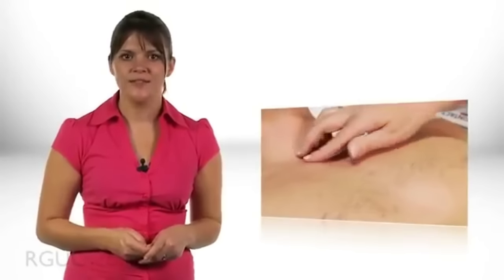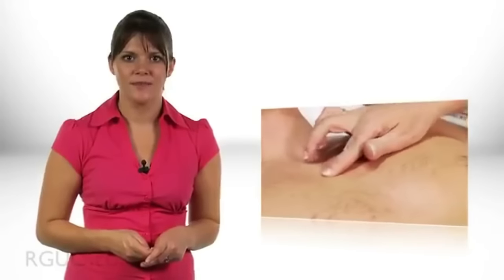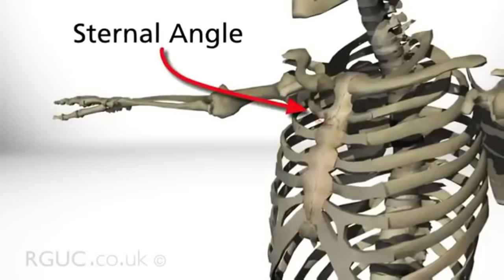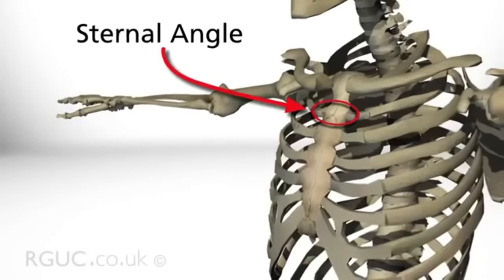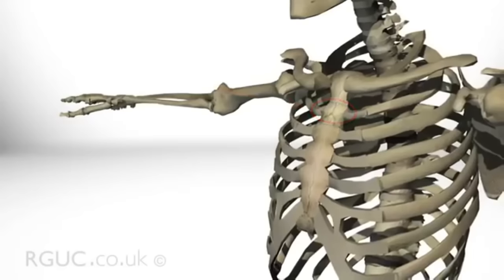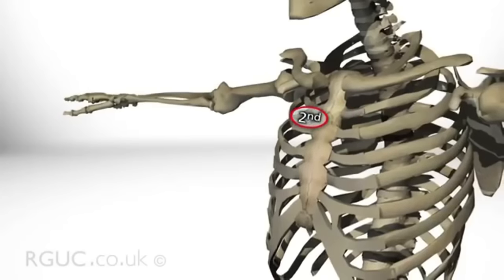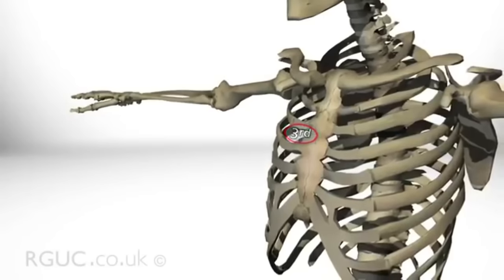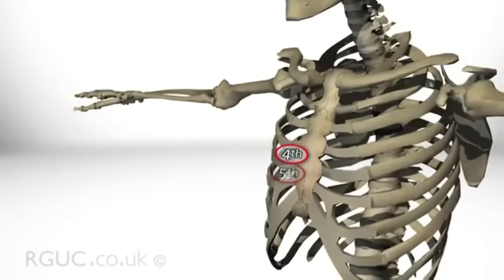Now move on to attach the electrodes for the chest leads. There are six chest leads. To locate the positions for these, use the sternal angle as a reference point to count down the intercostal spaces. The second intercostal space is directly below the sternal angle and from here you can count down to the third, fourth and fifth intercostal spaces.